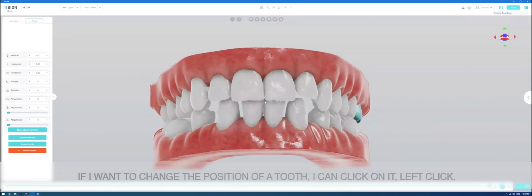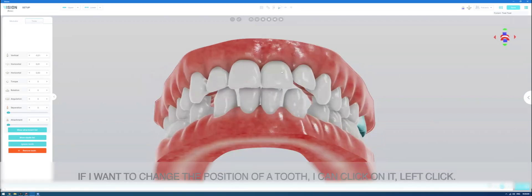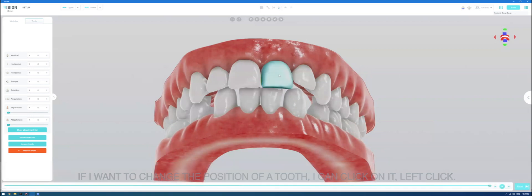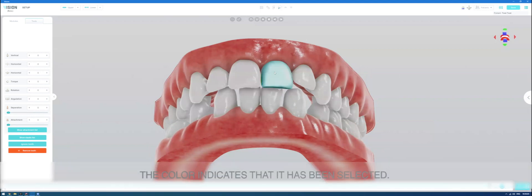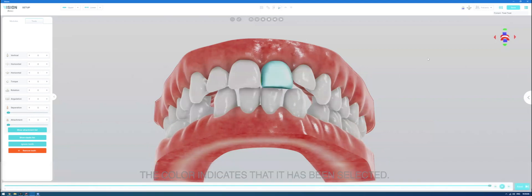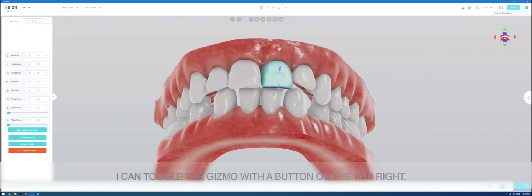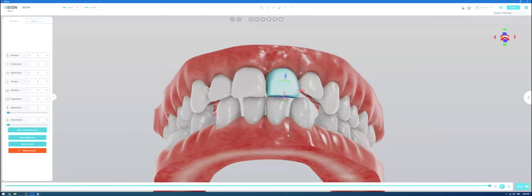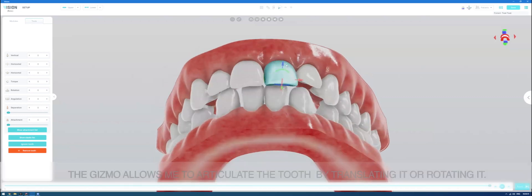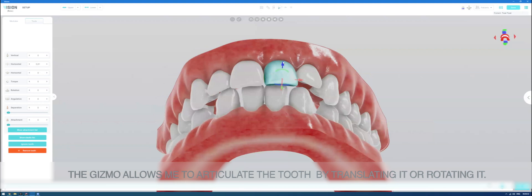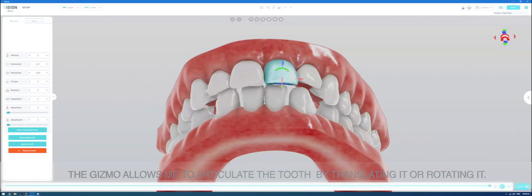If I want to change the position of a tooth, I can click on it, left click. The color indicates that it has been selected. I can toggle the gizmo with a button on the top right. The gizmo allows me to articulate the tooth by translating it or rotating it.